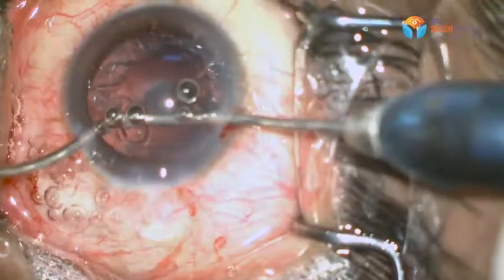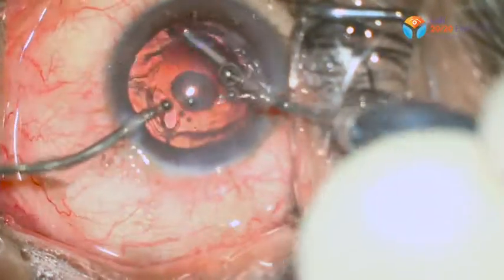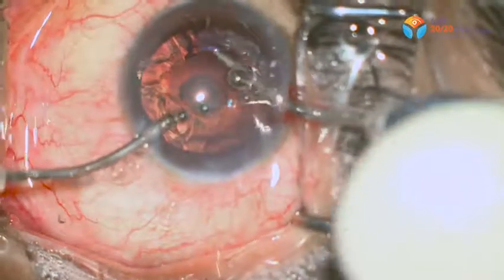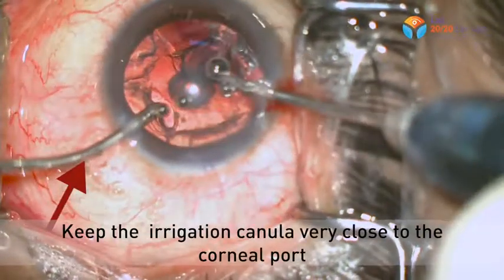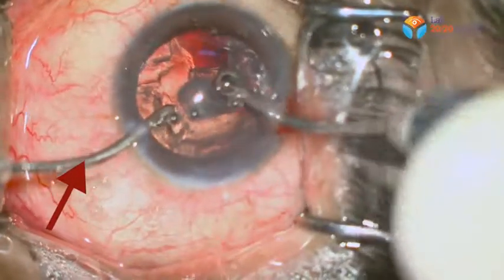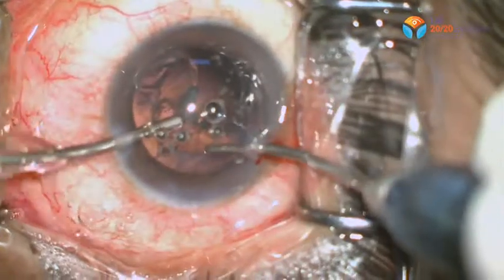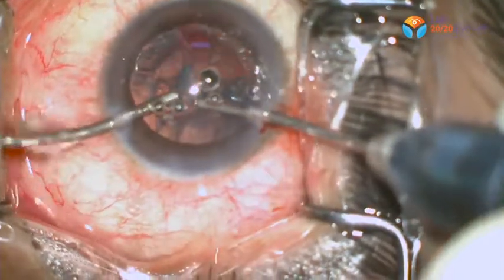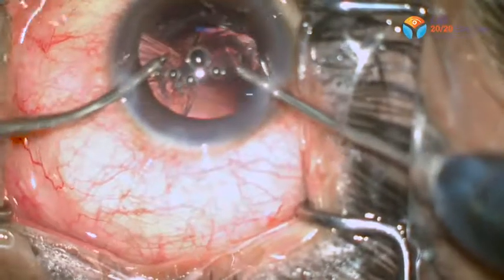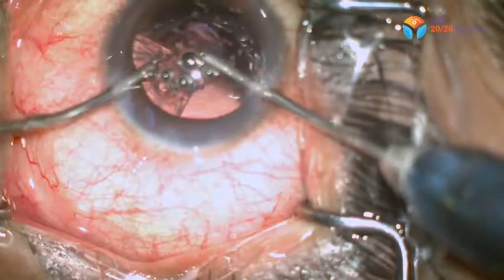I aspirated the initial air and now I start removing the cortex, gently starting farthest from the rent. Here I want to stress that I kept the irrigation cannula very close to the corneal port and aspirated the cortex with the aspiration cannula. The fluid dynamics are very critical throughout to prevent the fluid from entering the vitreous cavity. The fluid wave that is generated by the irrigation port is near the cornea and away from the posterior capsule.